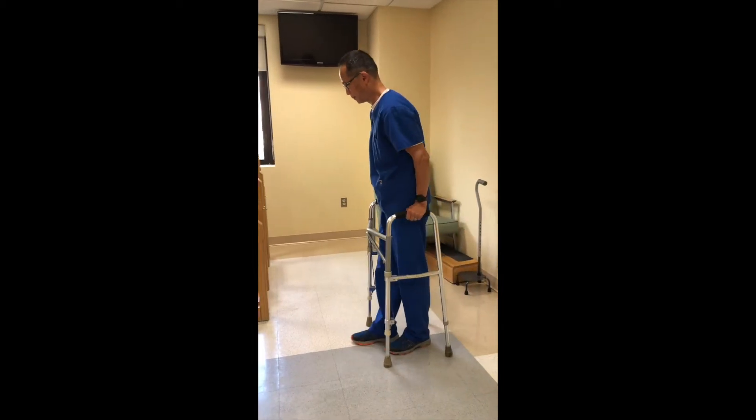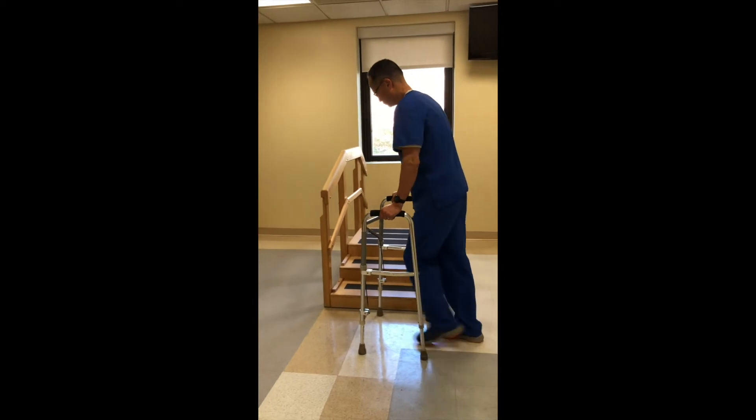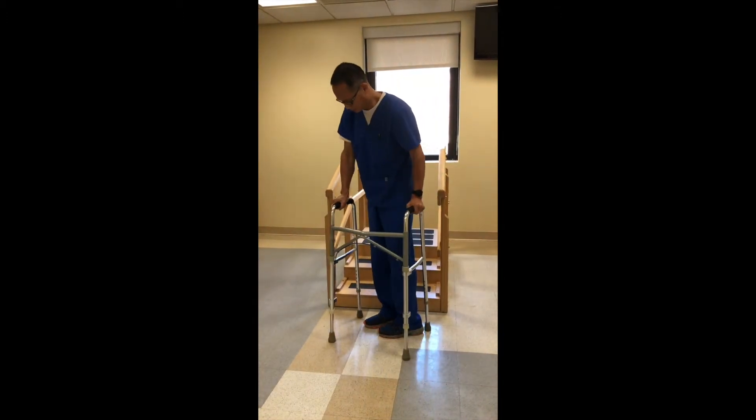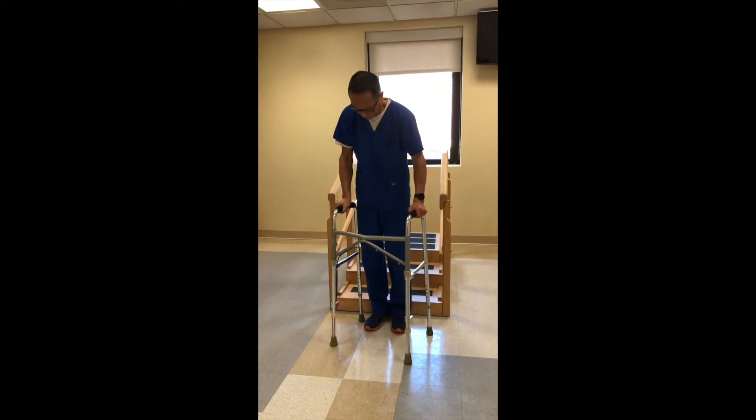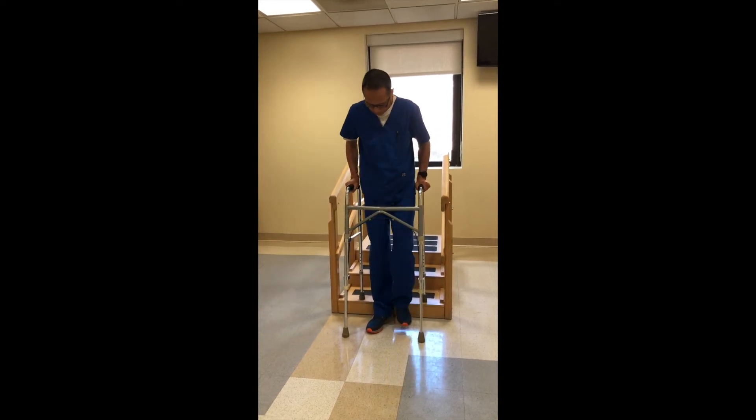In order to go up the stairs using this height-changing walker, first approach the stairs and then turn around so that your back is facing up the stairs. Lift the back legs of the walker so they are on the first step. Reach forward and grasp the handle, lowering the front legs.